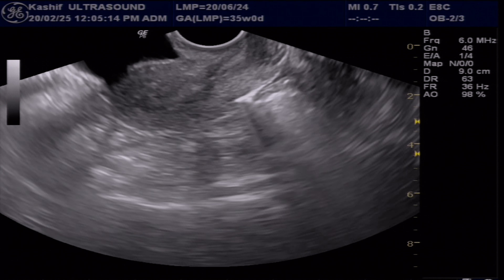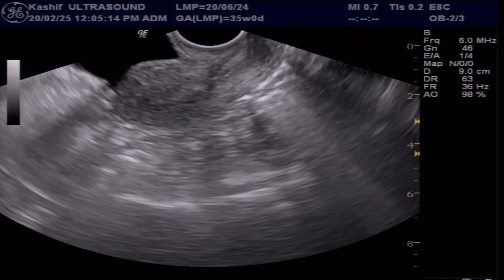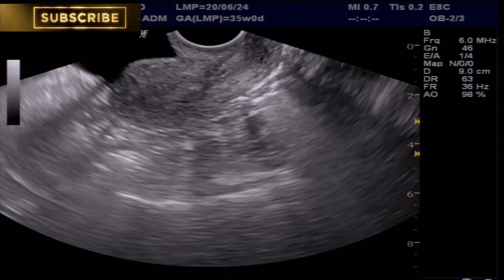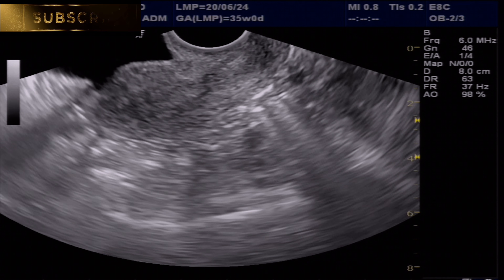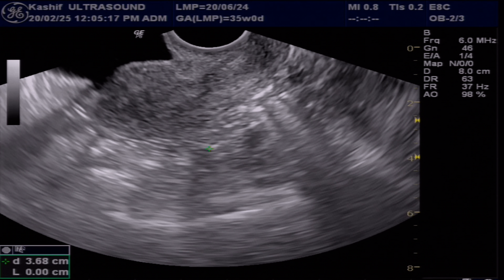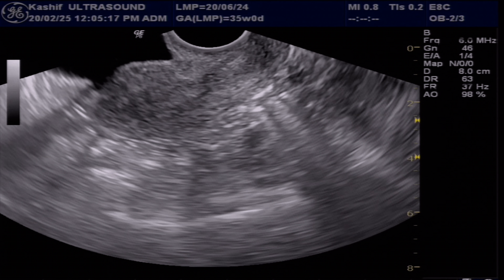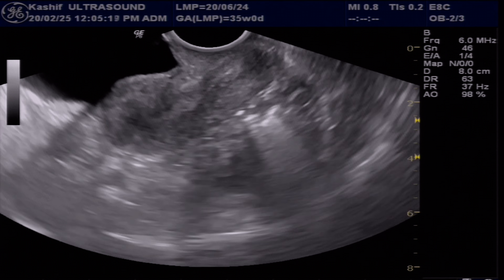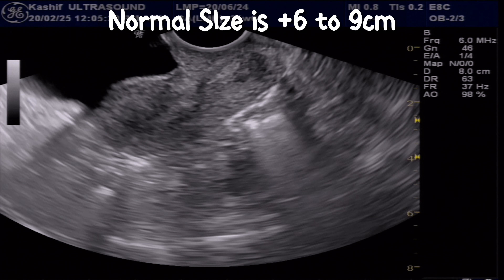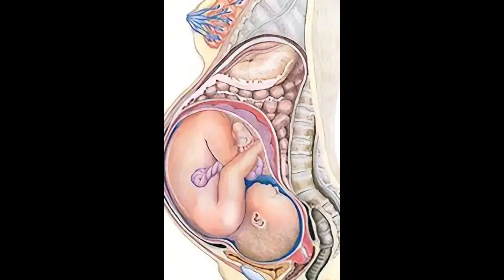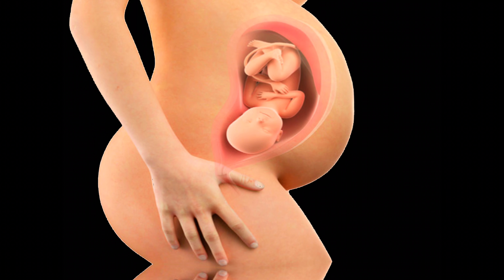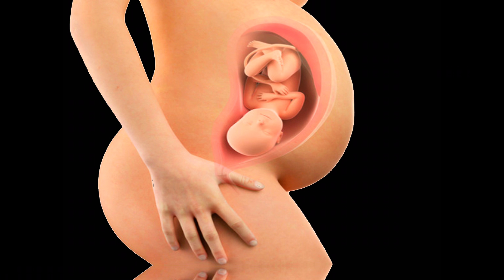The uterus is a hollow muscular organ in the female pelvis and plays a crucial role in supporting the growth and development of an embryo and fetus. The normal uterine size ranges from 6 to 9 cm. It is a soft, stretchable organ that expands during pregnancy or with age.